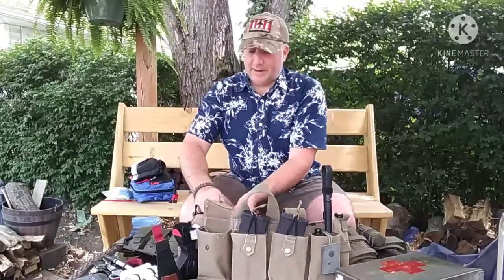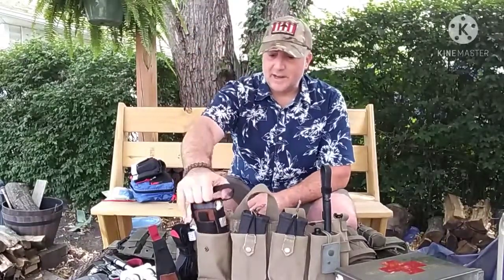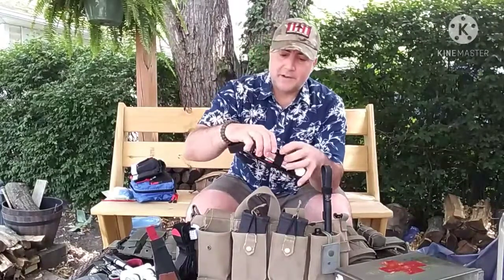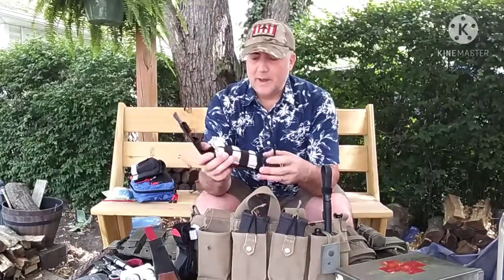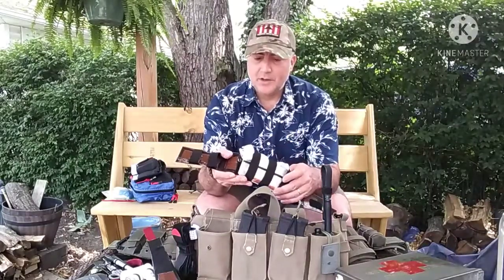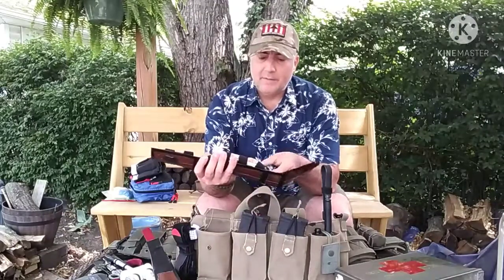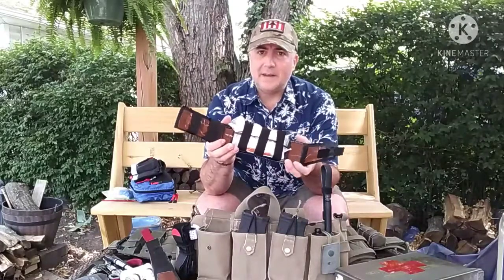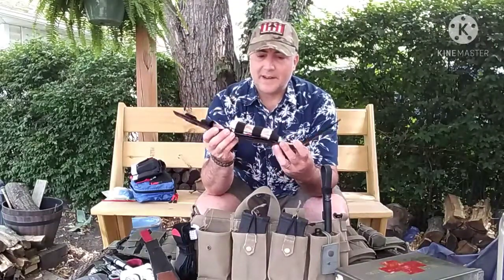So looking even at my other one, pull that one out. Once again, this one can be inserted into here without any issues, so you can swap one from the other. Once again, you have self-stick wrap, a nasal airway, a pressure bandage, chest seals, and a clotting sponge. All of that is in there for taking care of that immediate need until you can get them to more advanced care, or more advanced care can get to you.